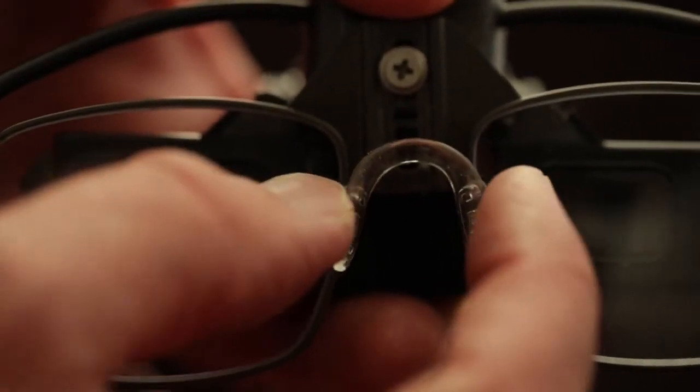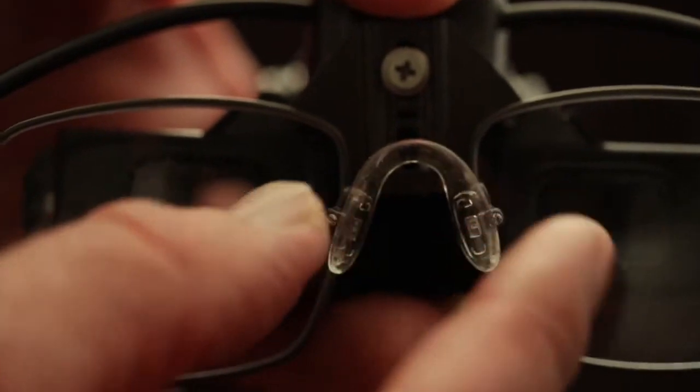If you find the optics are tilted or not level, simply adjust your nose pads and temple tips.